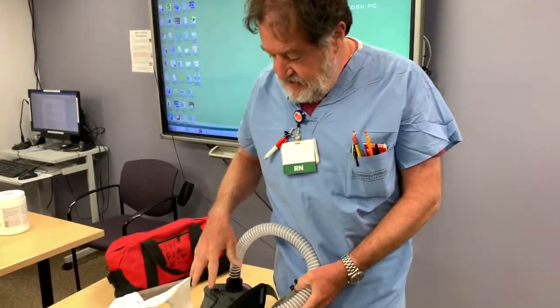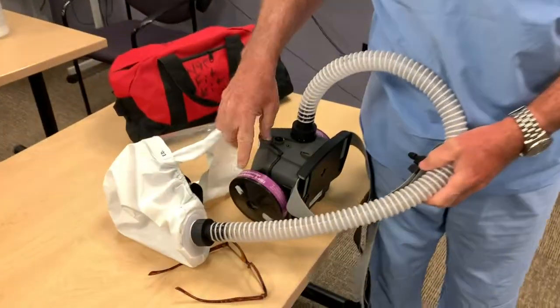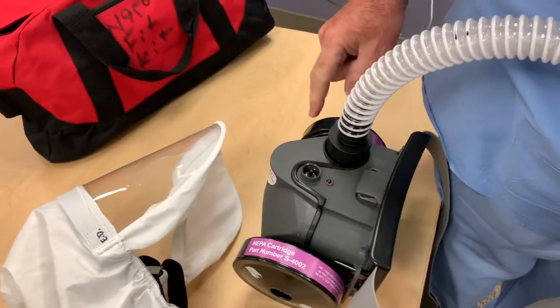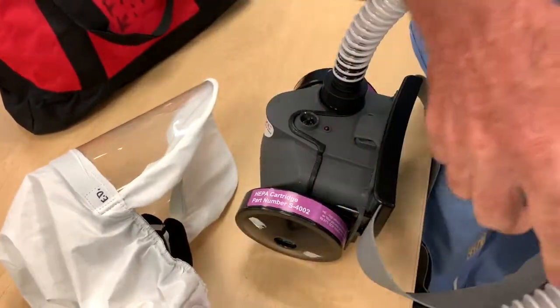This is the power unit. It's got the HEPA filter cartridges on. There are two — they just screw on if they're not already on.